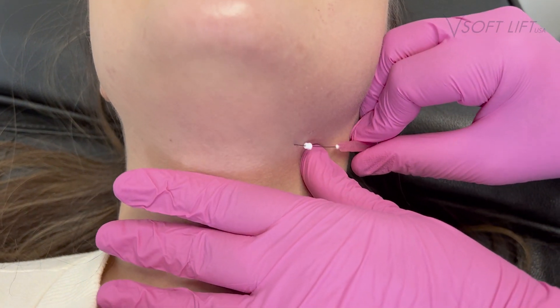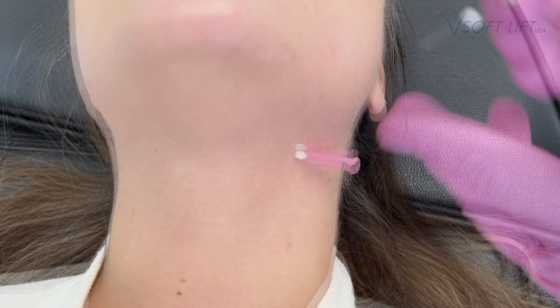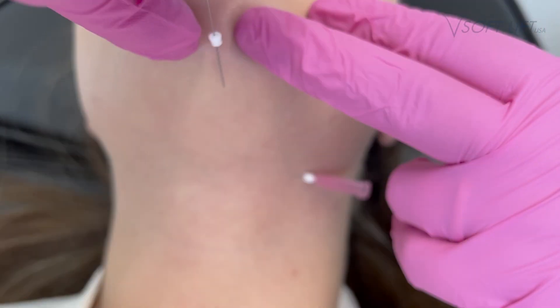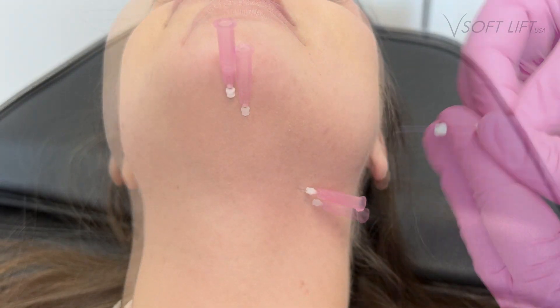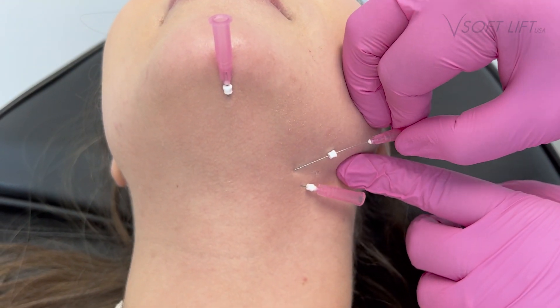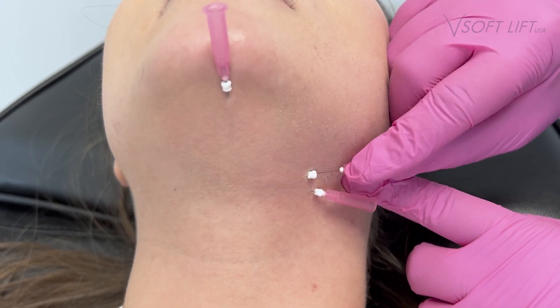Hello and welcome. I am Jill Charles. I'm a nurse practitioner. I work for the American Academy of Facial Aesthetics, and we work closely in conjunction with VSoftLift. I'm using VSoftLift PDO Smooth Reds on my patient today. I'm just going to walk you through that procedure.